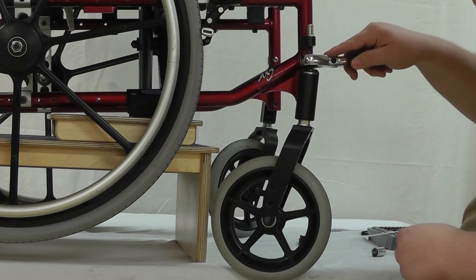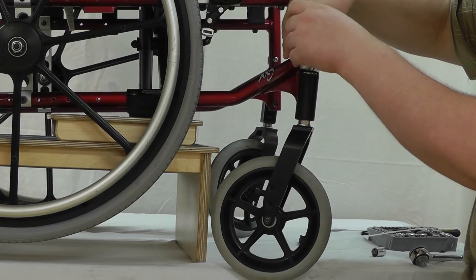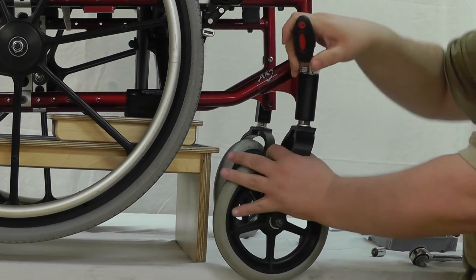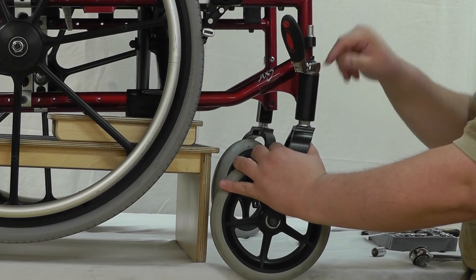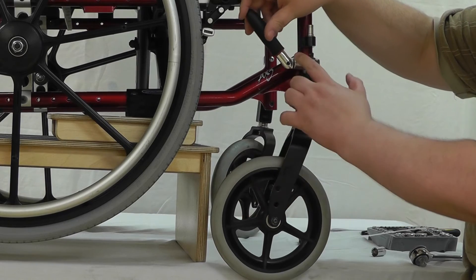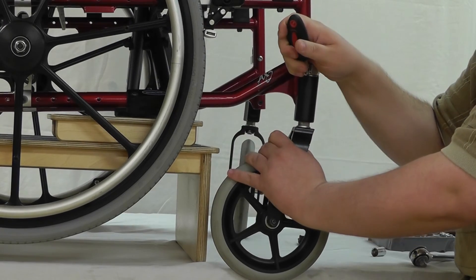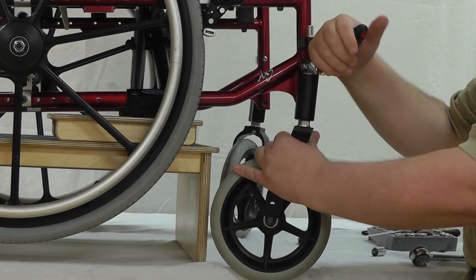Standard socket — pop that in. A deep well socket would probably be better, but you have to worry about your clearances here. An adjustable-neck wrench like this one — it's a Husky — works out pretty good, and you have a limited range to work with.